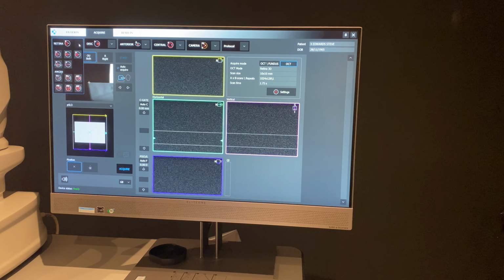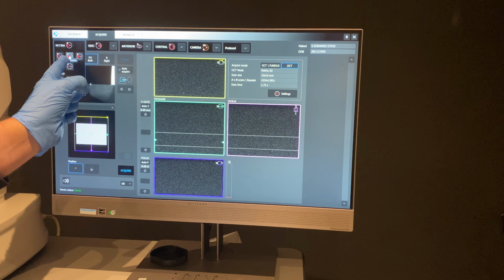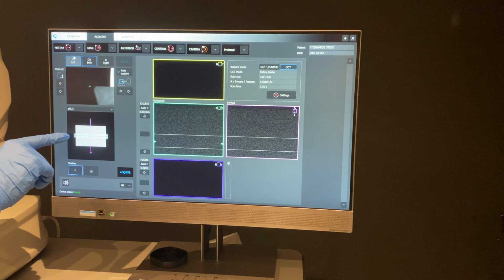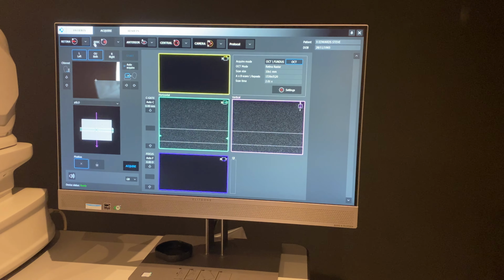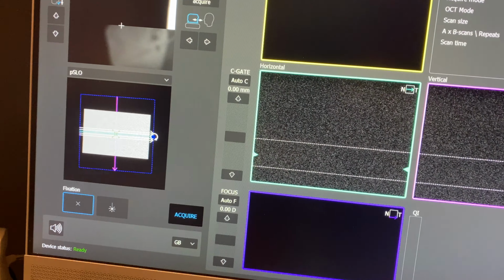But if you want a more high-definition view, an image only, you could, for example, select 5-line raster scan. But at the moment, the 5-line raster scan is going from 9 to 3. So you just get your rotation tool, turn it to 7, get the patient to pop back on, and do another scan.